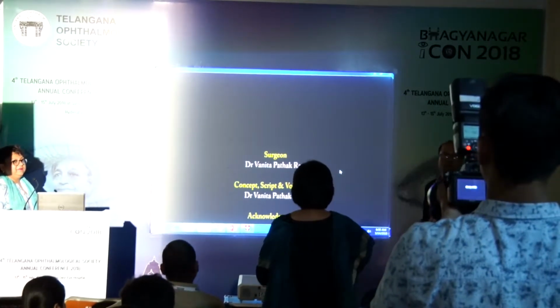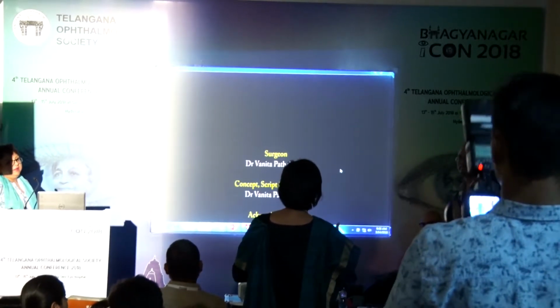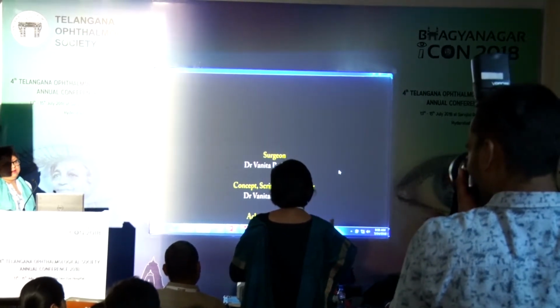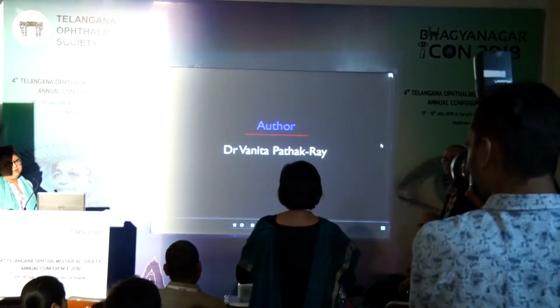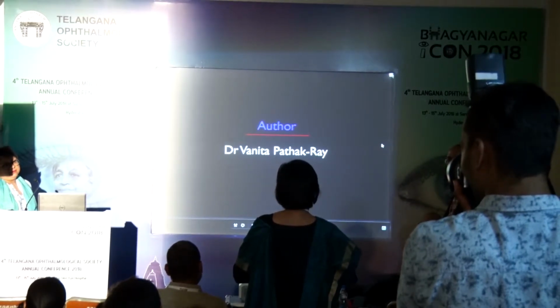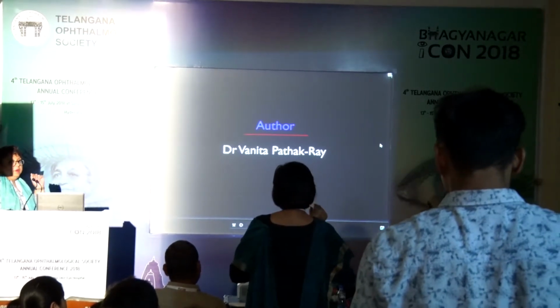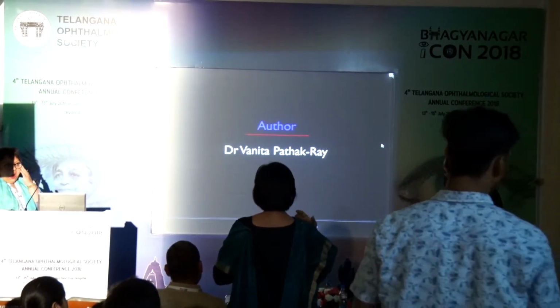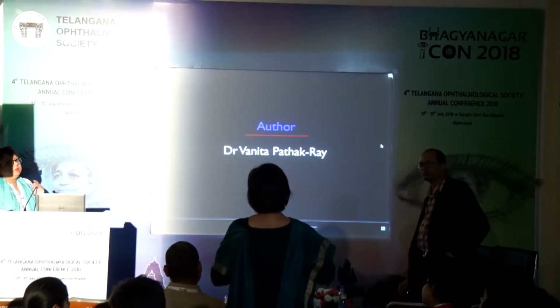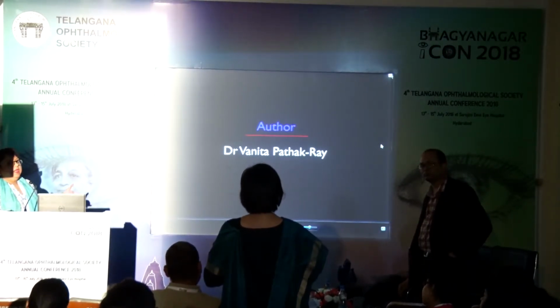Excellent videos, and yes, this vitrector we can use even now with the advent of the 25 gauge vitrector. So we have reported in the case of phakic eyes, with a 25 gauge vitrector, we can make an inferior iridozonulovitrectomy, and we have around 5 cases with 2 years follow-up with no cataract. By doing this focal zonulectomy, we are not really causing any progression of the cataract, nor is there any zonular dialysis. And in these eyes, once the AC deepens, that is the most important thing that we require at that moment. And all eyes are doing well.